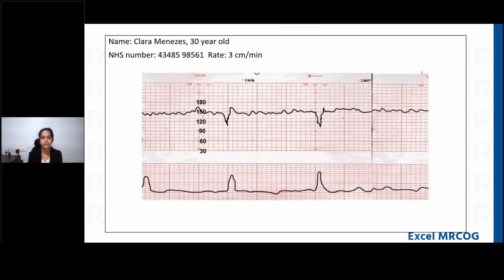But in here, actually, it is only up to 120. So it is not very significant. It is not a deceleration, since it is still 120. When coming to the, yeah, it is up to 120. That is acceptable only. And then the third one is late deceleration.